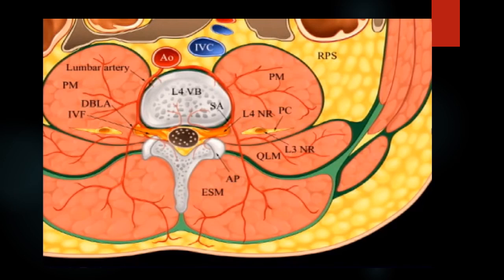They believed that branches of the lumbar plexus and parts of the sacral plexus were located close to each other in a compartment between the psoas major and quadratus lumborum muscles at the level of the L4 vertebra, and could be identified using loss of resistance.